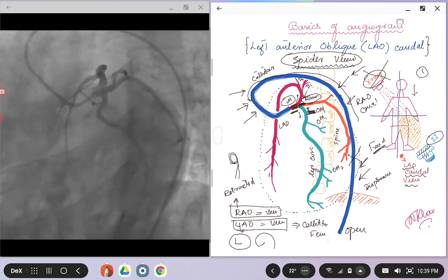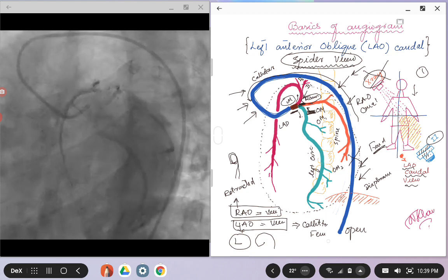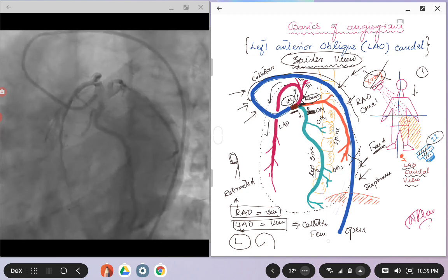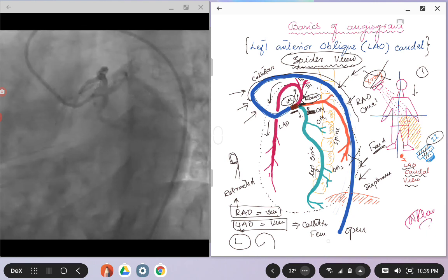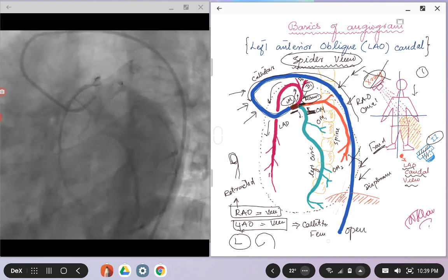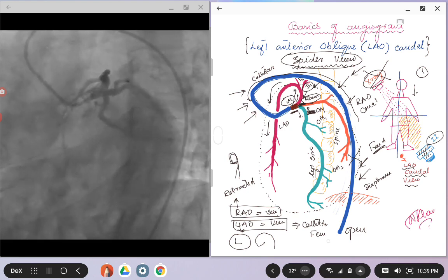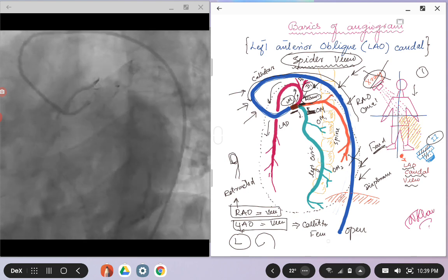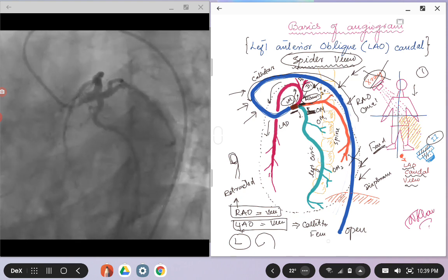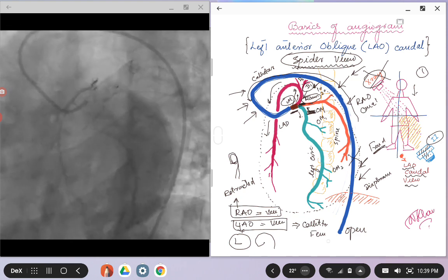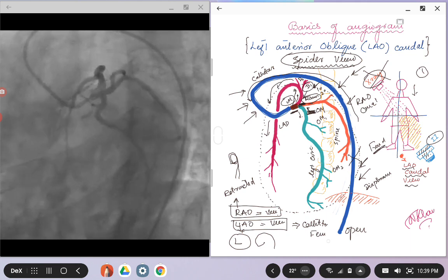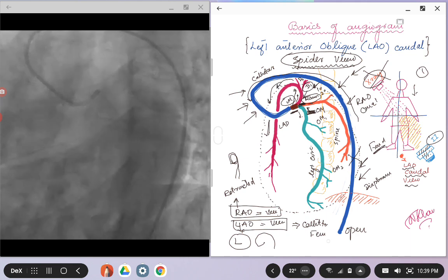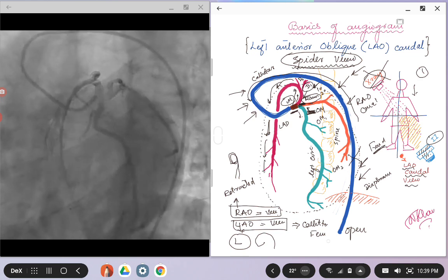The LAD, as we talked in the previous images, it will be going up and away from you, and then it will be foreshortened, and then coming down. The diagonal branches, you can see the ostium of the diagonal branches here as well, and they will be probably going towards one o'clock or two o'clock position. And then the LAD will be kind of looping around and then coming down, as you see in this picture.